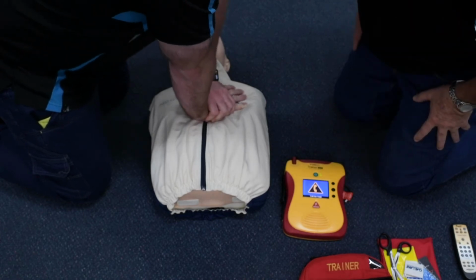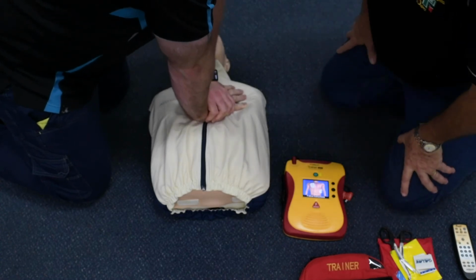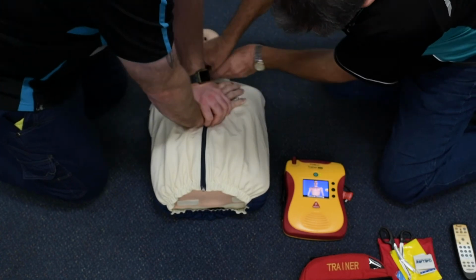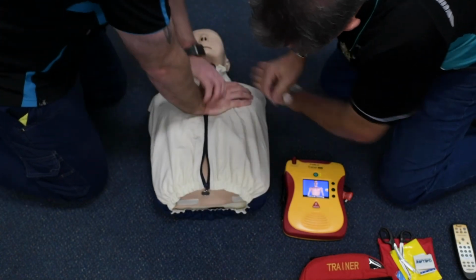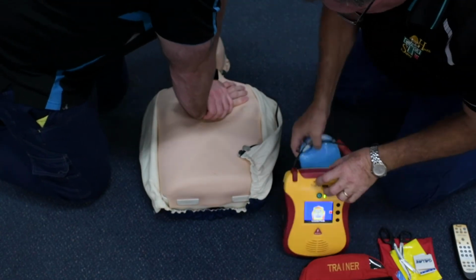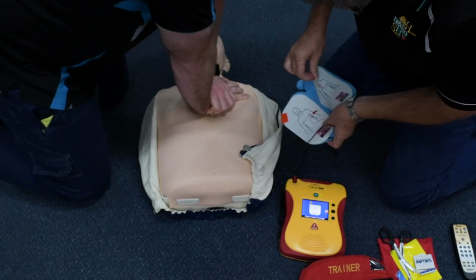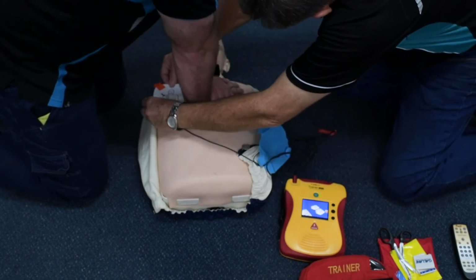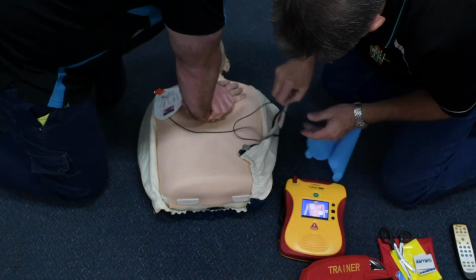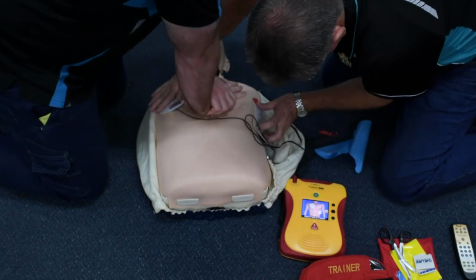Training mode. Call for help. Follow instructions to apply pads. Remove clothing from patient's chest. Locate pads package in back of AED. Tear open pads package. Peel pads from blue liner. Apply pads to patient's bare chest as shown.